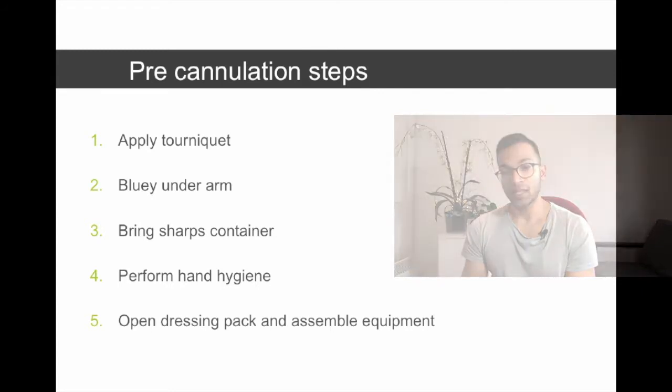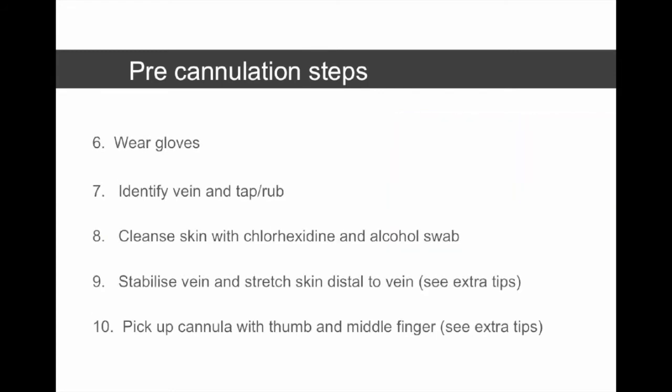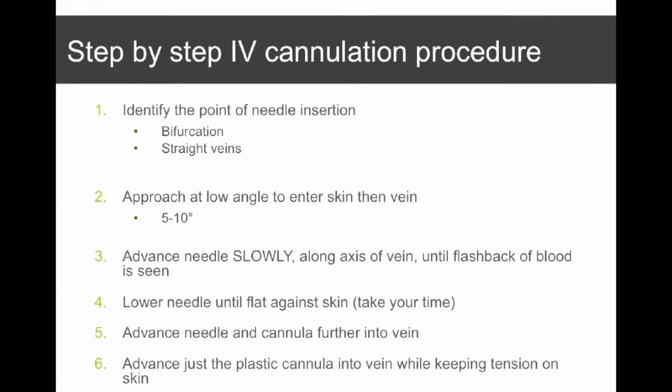Open the dressing pack, assemble all your equipment, always wear gloves, identify the vein and tap and rub as required, then cleanse the skin with chlorhexidine and alcohol in a swab. I then stabilize the vein, stretch the skin distal to the vein, and I'll go through that in extra tips. I pick up the cannula with my thumb and middle finger, and then we try to access the vein.